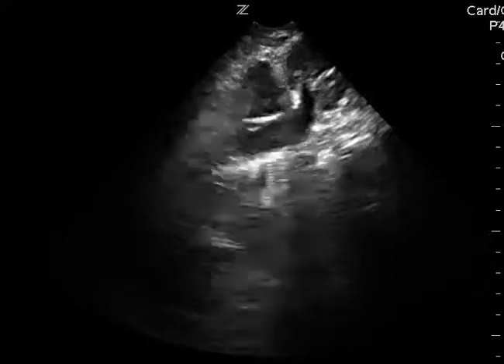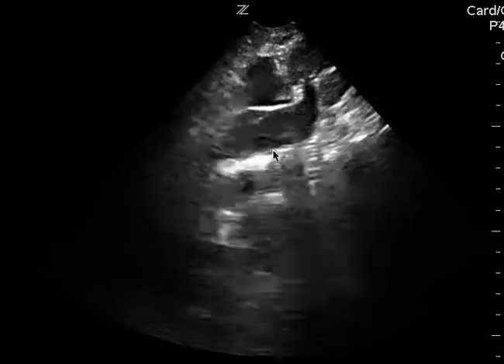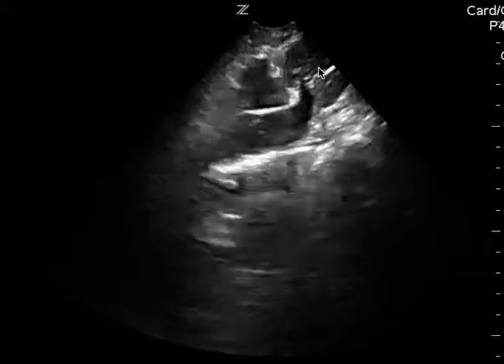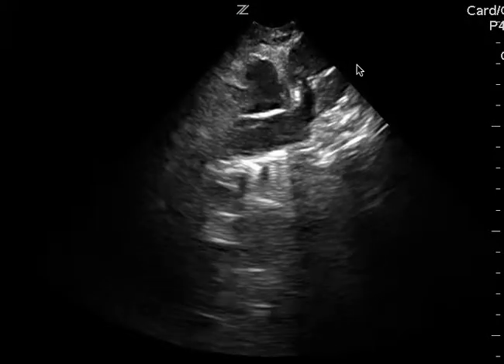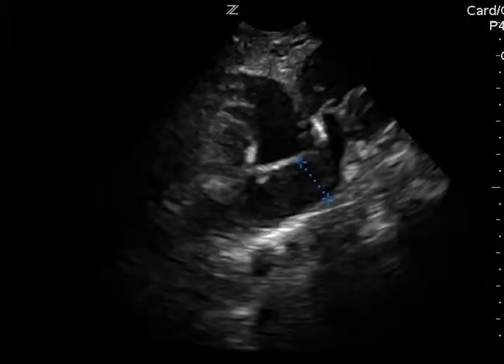The last thing to talk about is what I believe is an IVC ultrasound, and I'm not going to lie, I'm not really sure of where we are in our orientation. I thought maybe this was the liver, but then why is there so much space here between the heart and the liver? So I'm not really sure exactly where we are. But one thing I do want to mention is that there was a measurement, and I personally think measuring the IVC is a waste of time.